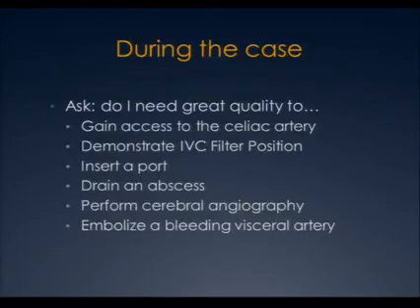second. But the average operator walks in and just uses whatever is set up. If I walk into my neuro rooms, we overflow to the neuro rooms. The neuro rooms are all set at 15 frames a second. And if you don't know it, you're just operating at a huge dose.